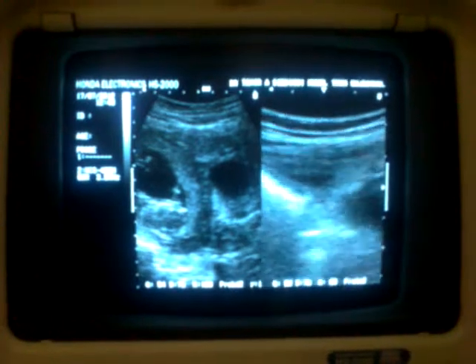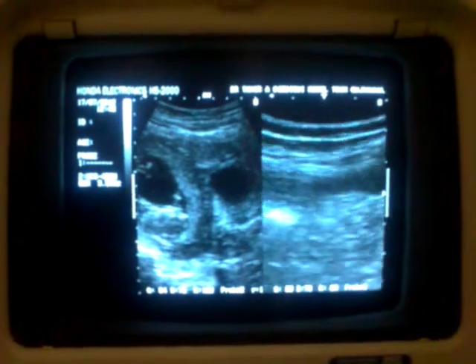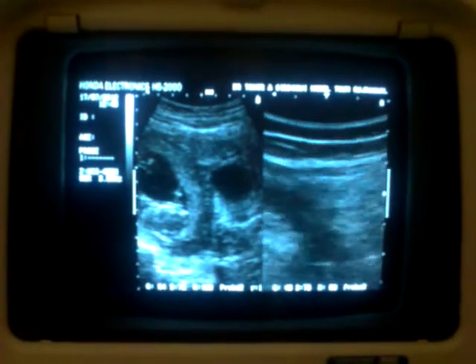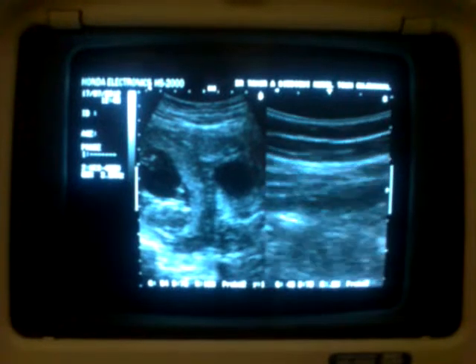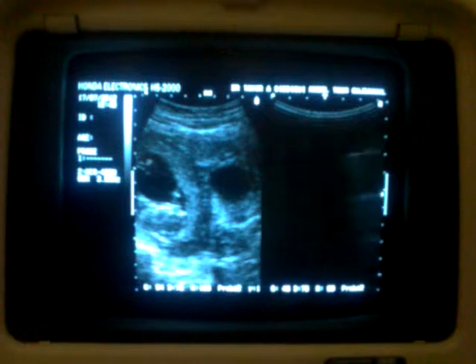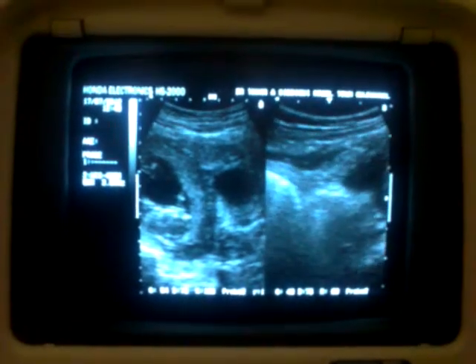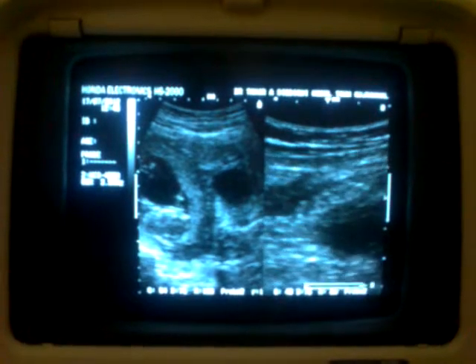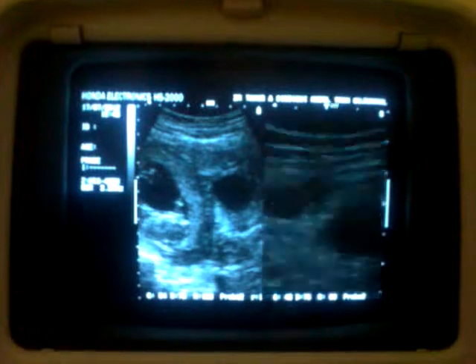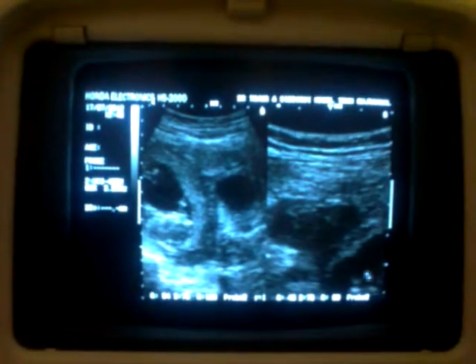So, and now from this sac, you will see fluid along the. Now remember, this is the third sac with an echogenic ring, as this is the second one with fetus.